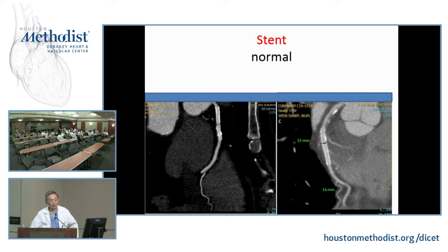I presume the size of the blooming artifact for calcium is less as you have higher resolution? Higher resolution, and also heart rate is probably more important. Cardiac motion tremendously magnifies the blooming artifact caused by the calcium. Especially with the newer scanners, I think Toshiba now has a 0.25 detector thickness scanner. You can give enough energy, and if you have a slow heart rate, I believe most of the coronary segments, more than 1.5 millimeters, could be evaluated adequately. But again, we don't have the technology.